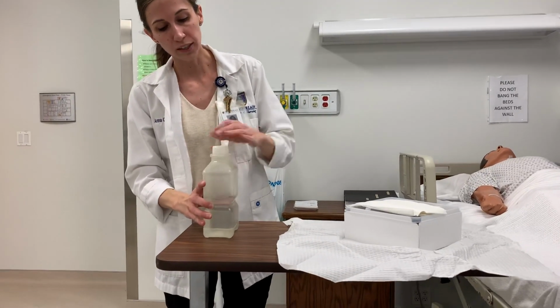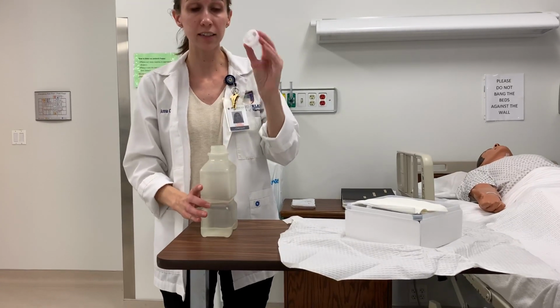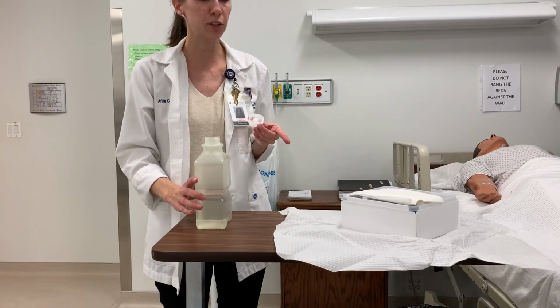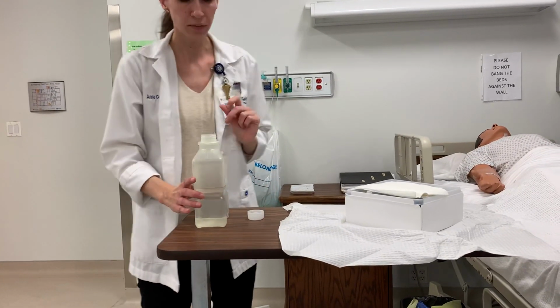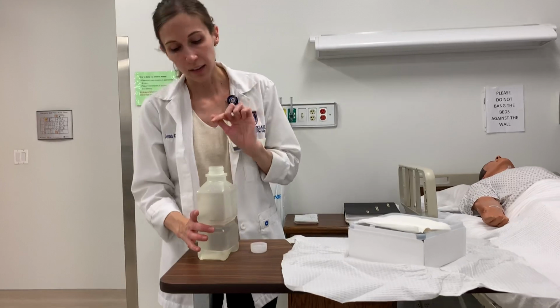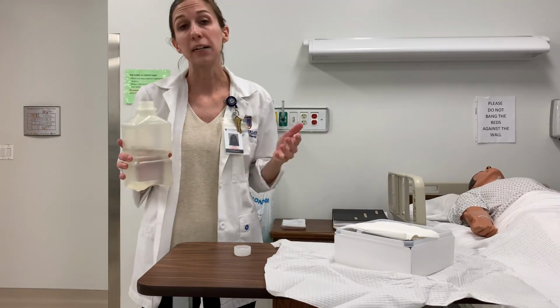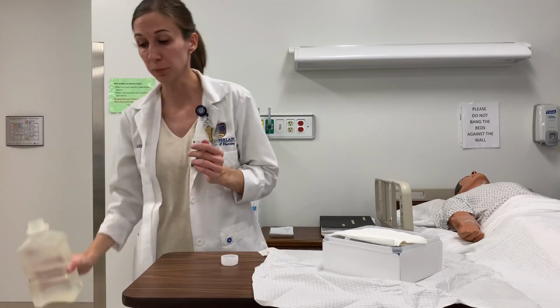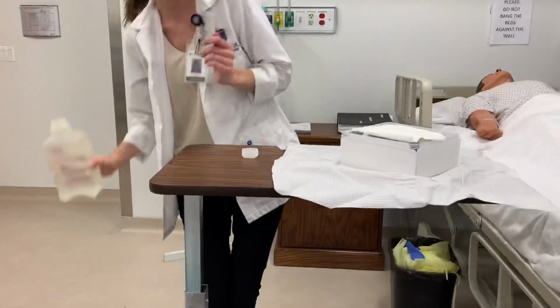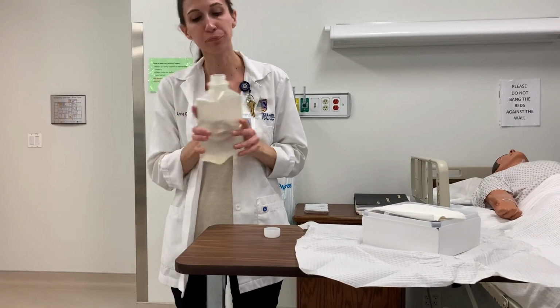I would remove the lid. When I place the lid down, I cannot put it on my sterile field, otherwise I will contaminate it. I can place it face up like that though. I would make sure that I lip off a little bit of fluid into the garbage can, so a plastic lined garbage can. I'd have one over here that I would lip off. Again, I don't want to bring it all the way down here because then we're contaminating again. Keeping it up here, pouring it off into that plastic lined garbage.